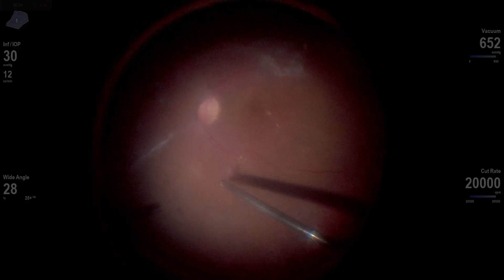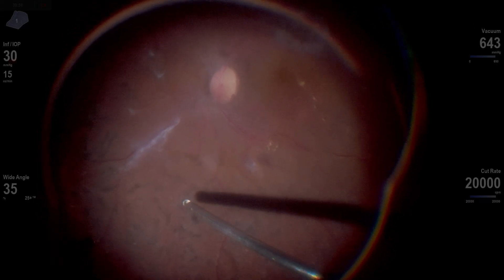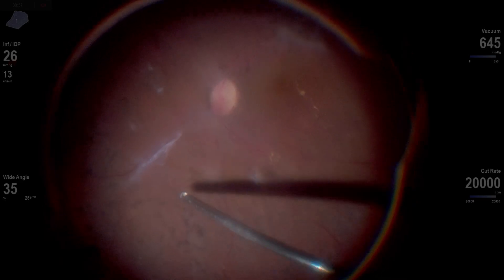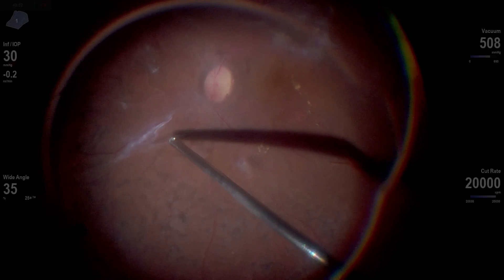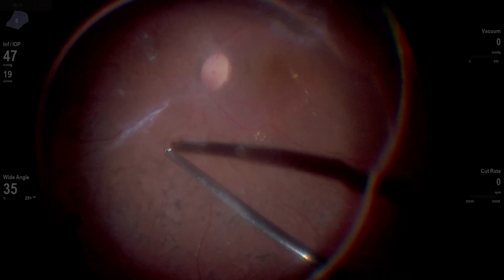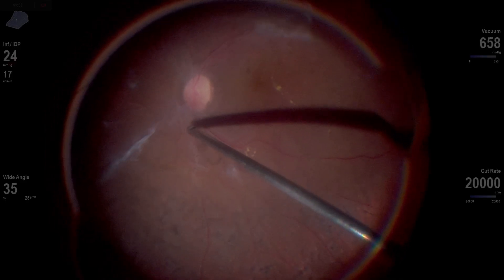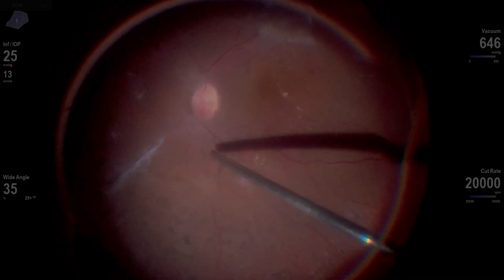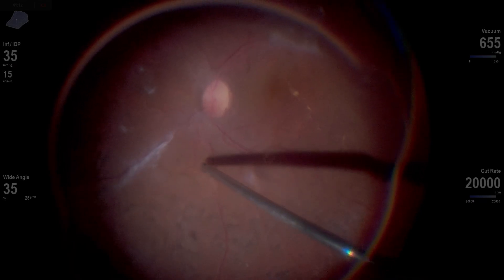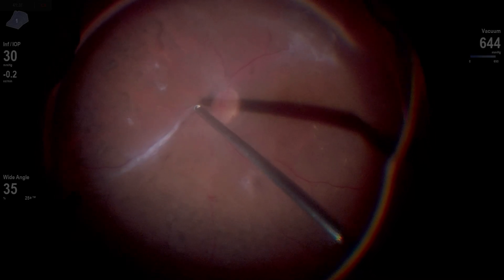I always tell our fellows that diabetic surgery is like defusing a bomb. You don't know how long you have — sometimes patients start to feel sick, their back hurts, or they get pains that prohibit them from staying flat on the table for two or three hours. So you want to work expeditiously. I always feel there's an added pressure to get this done as efficiently as possible. But in a case like this, I'm really kind of struggling to get a rhythm and find some dissection points.